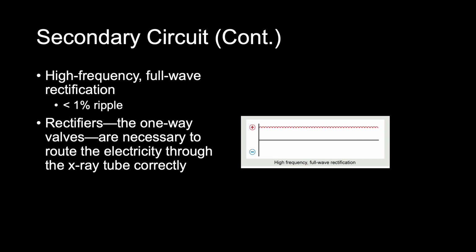The X-ray tube, with the exception of the filaments, is a part of this section. And because the X-ray tube head assembly is the subject in Chapter 5, we won't really talk about that until we get to that chapter.